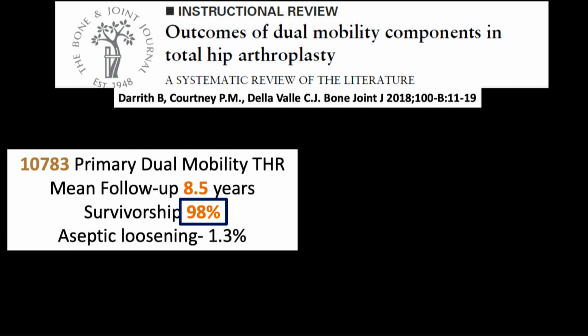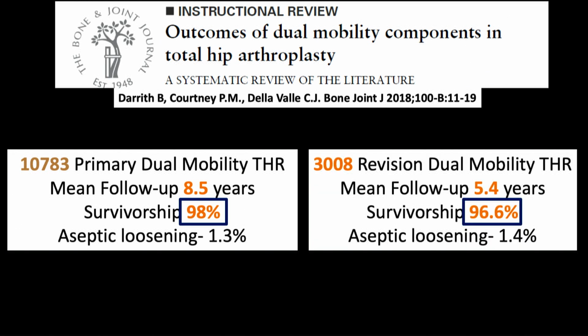Based on a systematic review of literature, when done around 10,000 primary hips, the survivorship was 98% mid-term. In the revision scenario, mid-term survivorship was 96%. The long-term survivorship data from other authors is still not available.